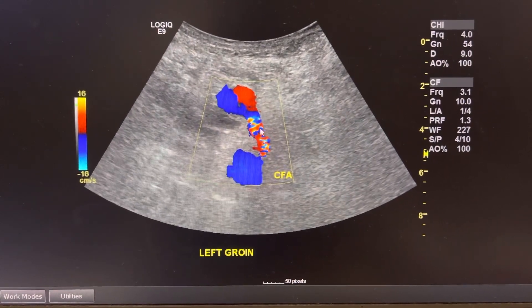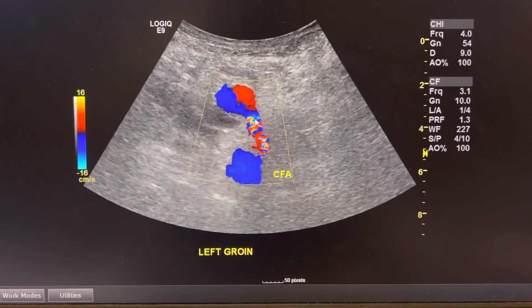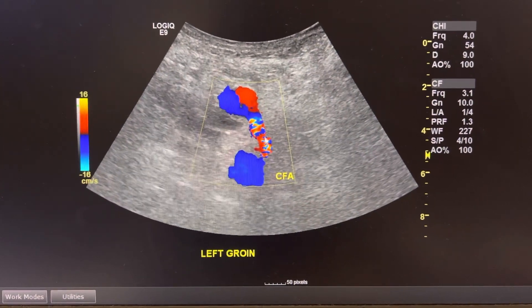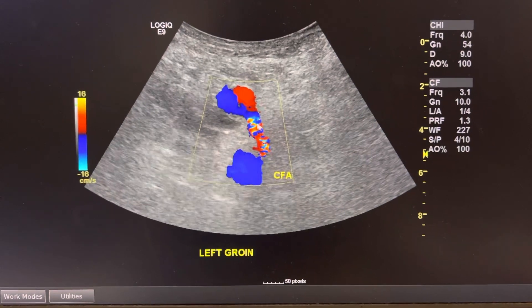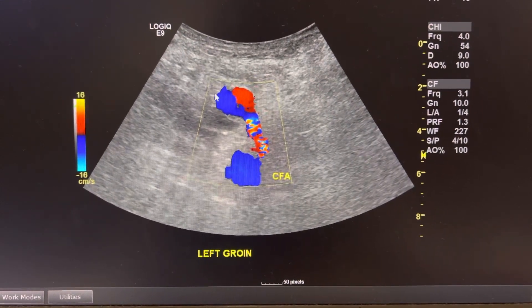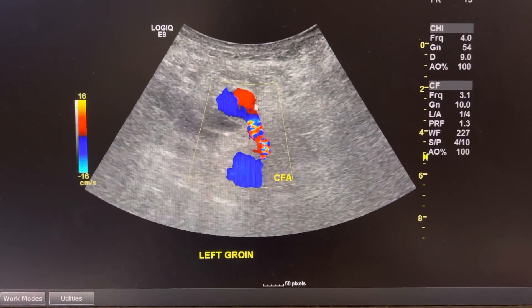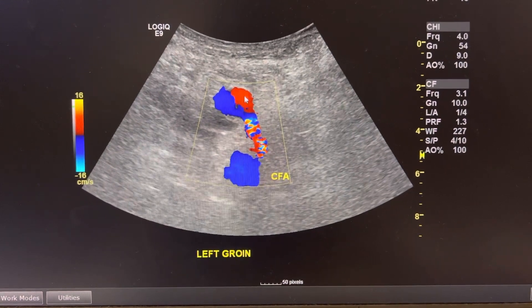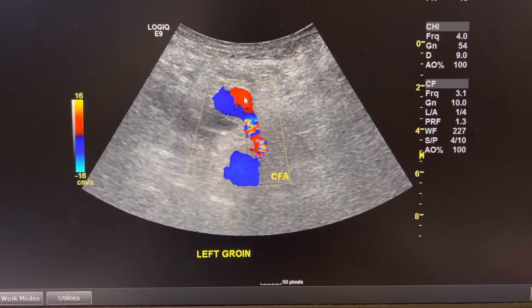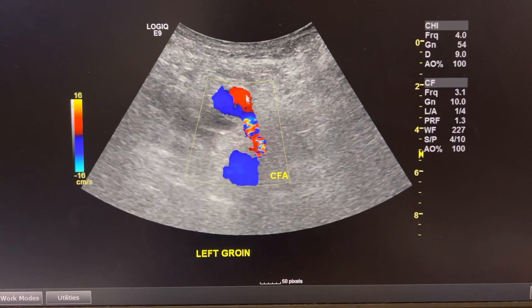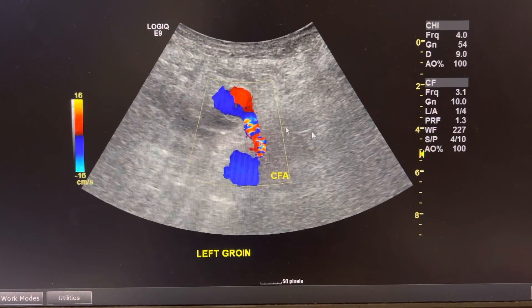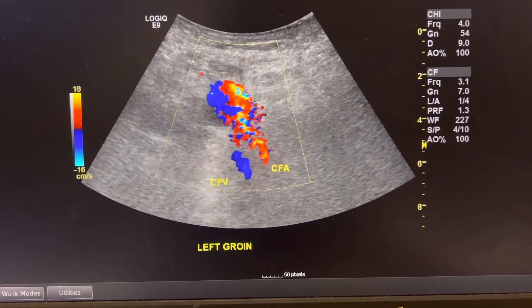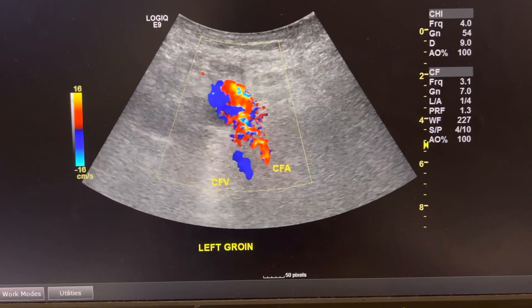You can see from the common femoral artery that there is this long neck-type stalk here that comes off of the CFA and goes into the pseudoaneurysm right here. This has the classic yin-yang sign where it's red and blue because it's swirling to and fro. I finally saw it — I was like, whoa, there it is.